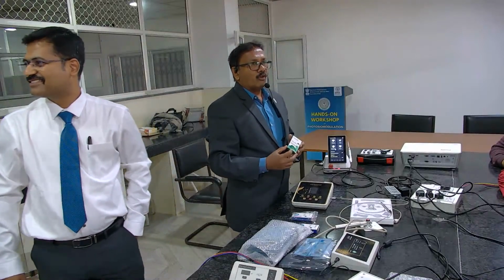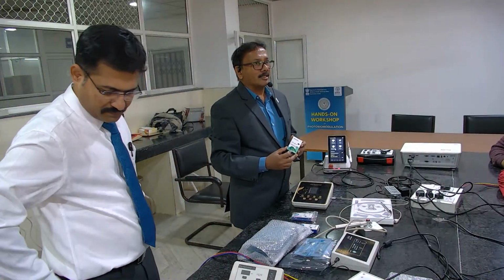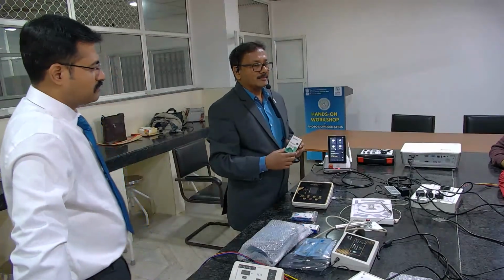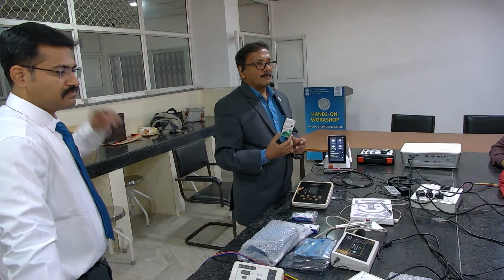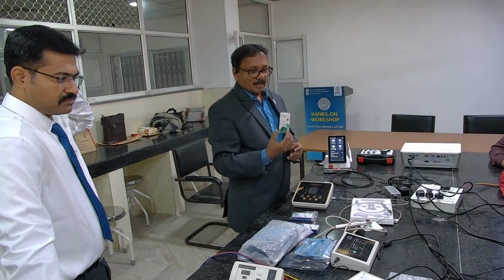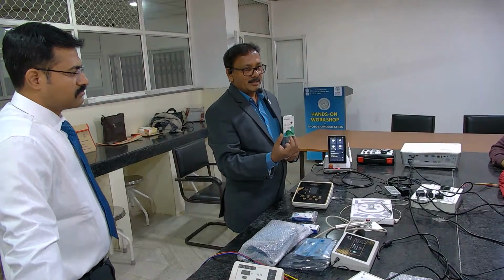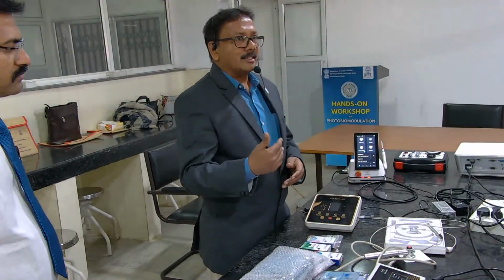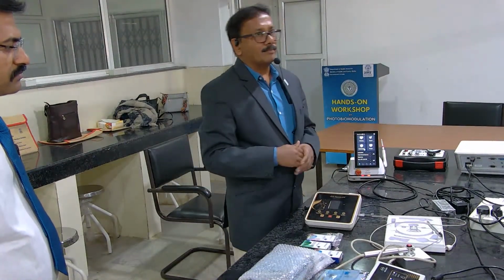So don't fall for the dealer's claim that sir, ours is 8 watt, 10 watt. The right question to ask the dealer is what is your wavelength, exactly, because if you're using 810, it's always indocyanine green, right? I will be covering it in detail tomorrow in the theory period part.